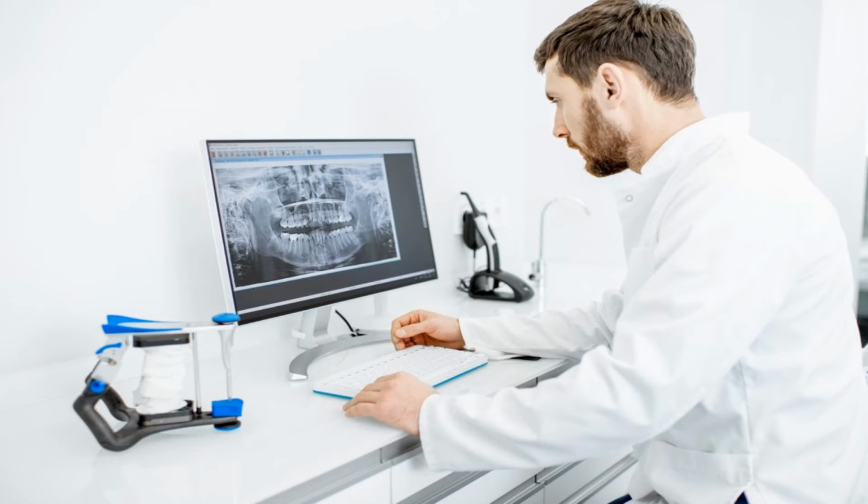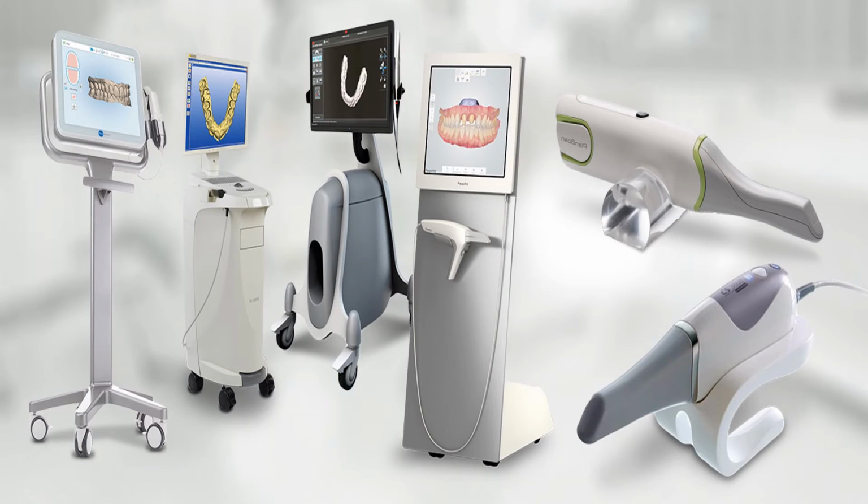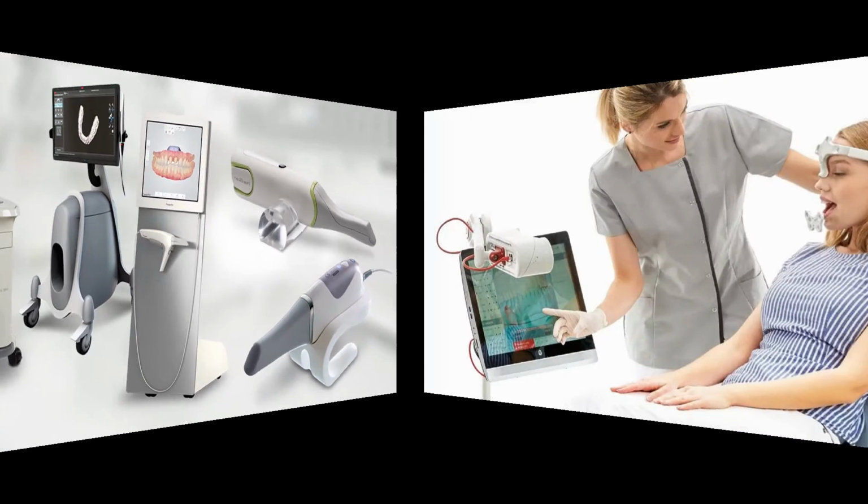Computers can be used in the field of dentistry. They are used in the administration field in dental clinics, hospitals and dental institutions. Computers are used in patient records storage and retrieval, patient evaluation, examination and treatment planning, patient motivation and awareness, and appliance designing using CAD and CAM techniques.